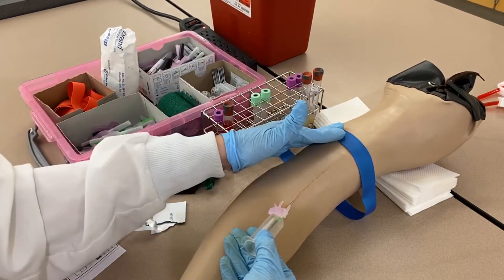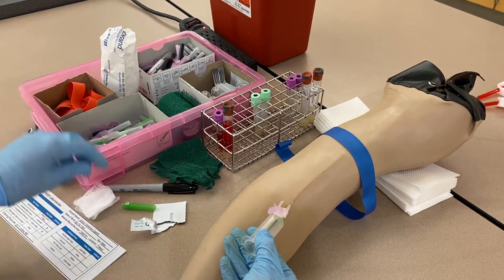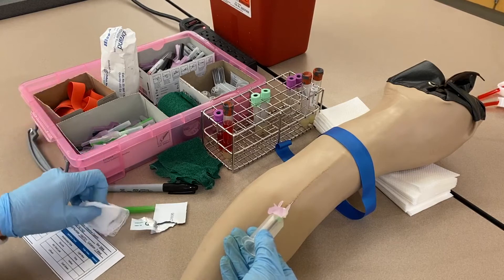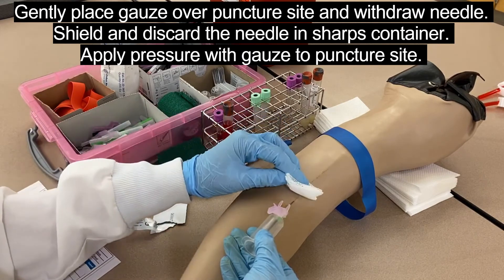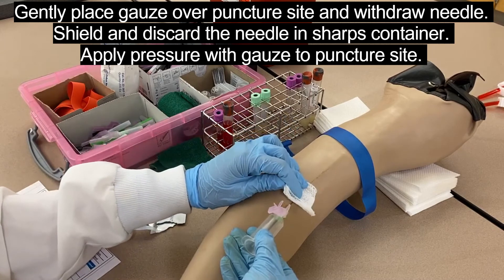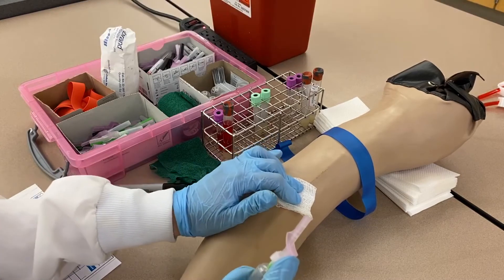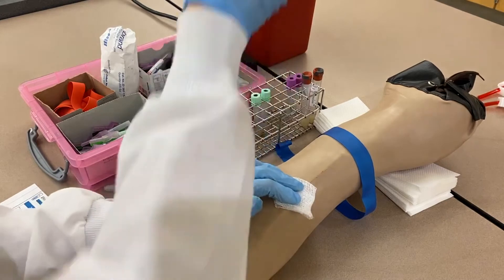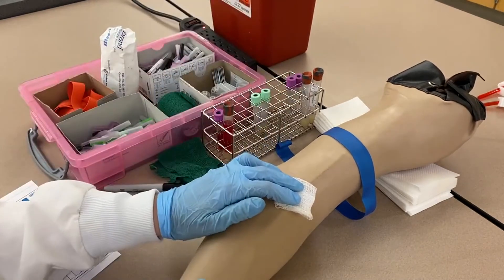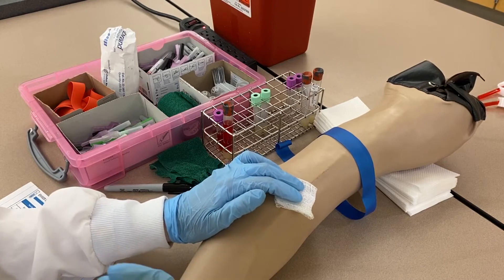Before taking the needle out, make sure the tourniquet is off and have the patient release their fist. Gently place the gauze over the needle without pressing down, then pull the needle out and cap it using the safety feature with your thumb — you can also do it against the table. Dispose of the needle immediately. Your first job as soon as the needle comes out is to shield it and get rid of it to avoid an accidental needle stick.